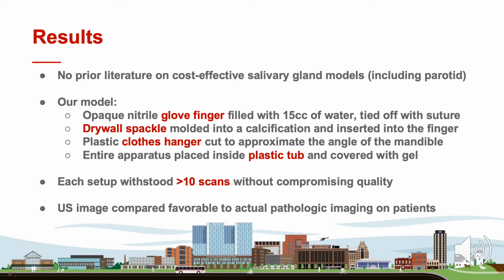Each setup was tested at least 10 times to ensure that the image could withstand repeated scans without compromising quality. Our goal was to have a model used repeatedly by different medical students, and we wanted to ensure that repeated scans would not compromise the image quality or alter the pathology in any way.